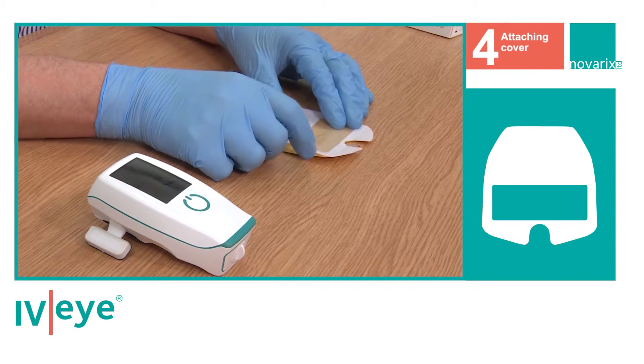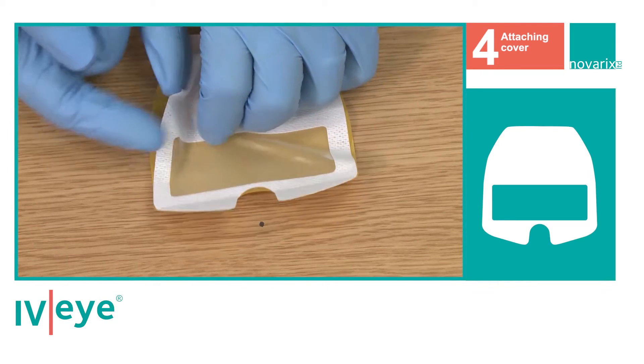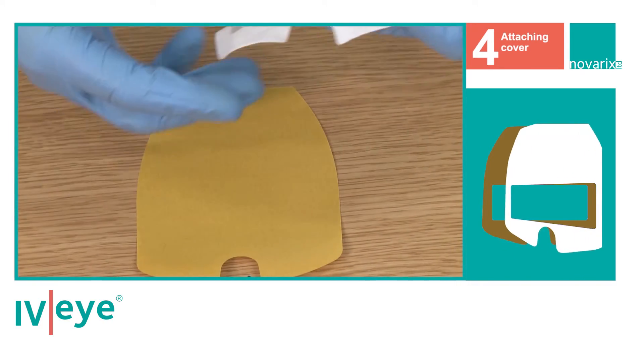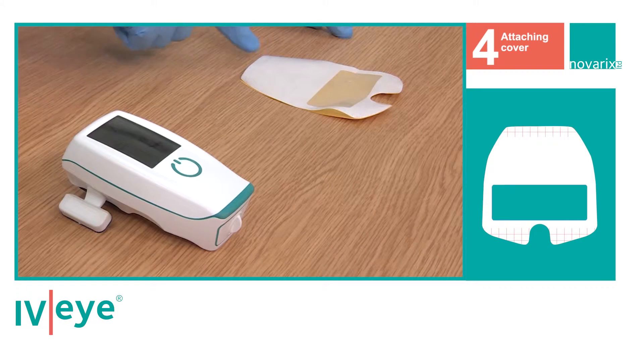Place the cover back-side down on a flat surface. Peel the disposable cover from the backing film, then invert the cover and position it face down on the backing film with the sticky side facing upwards.